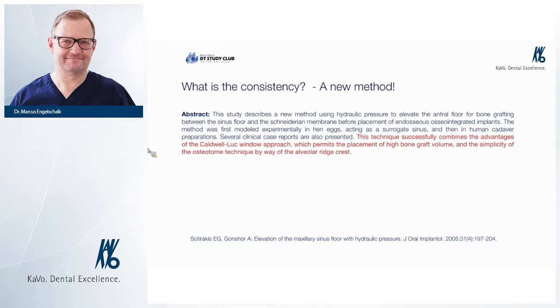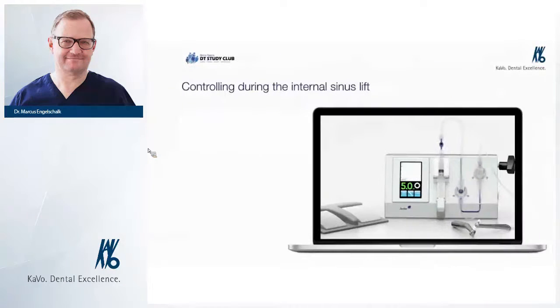So, drilling now to the bone and pressure-sealed positioning of the so-called Jeder drill, pressure build-up to 1.5 bar, and oscillation is very important. And then now you can slowly, at the time of a minimal perforation, water will go everywhere.